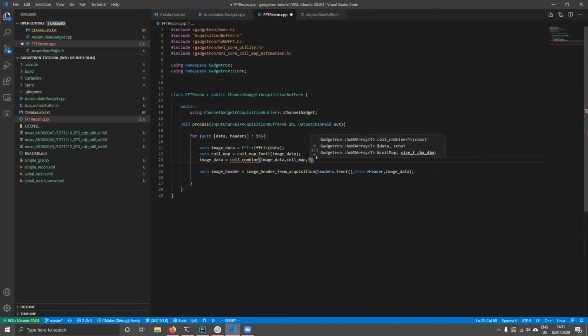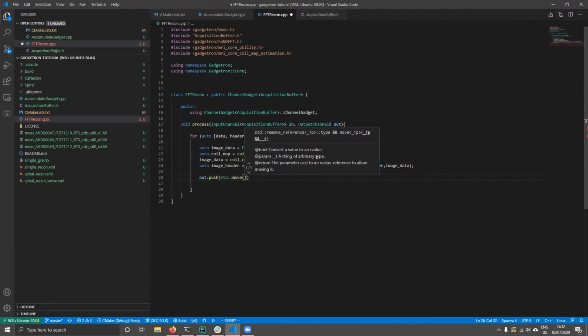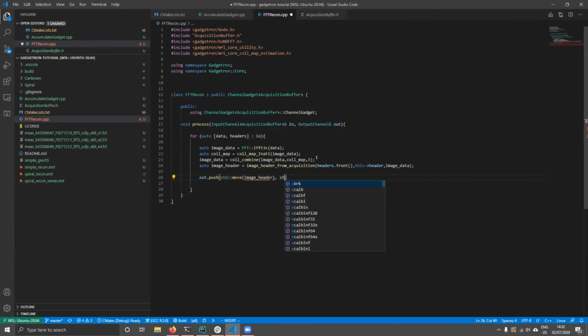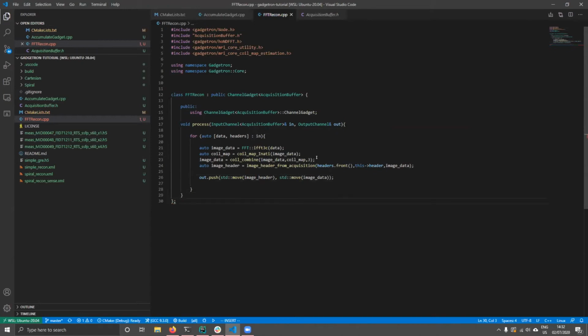And it wants to know what dimension we have the coils in. We have it in dimension number 3. Okay, well, let's push some things. We're gonna move them as well because we don't need them anymore. We move the image header and we move the image data. And we are good to go. We need 2 more things, a semicolon here because of C++, and a secret gadget export command. Okay, we are ready to compile.